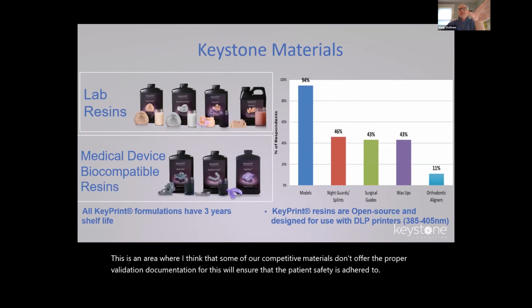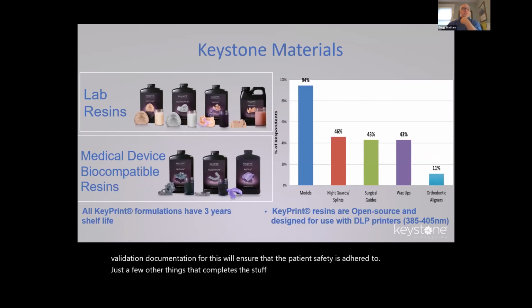Just a few other things that complete the stuff about the try-in, just a few other things about the materials that Keystone does offer. We have both lab resins and medical device resins.